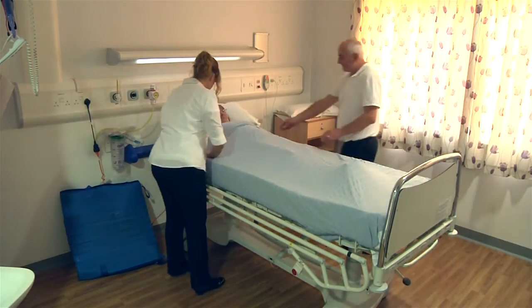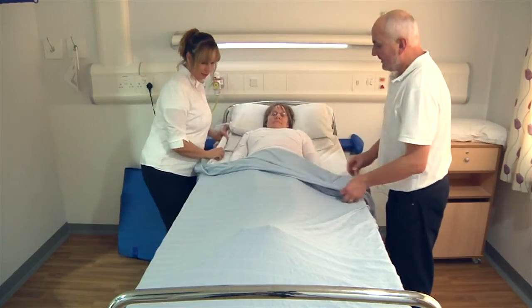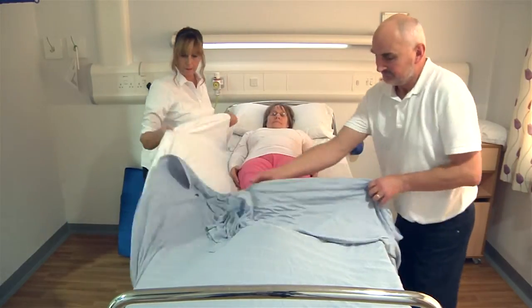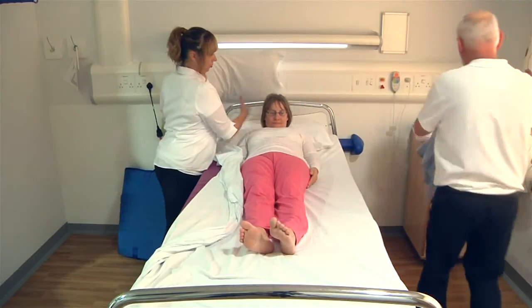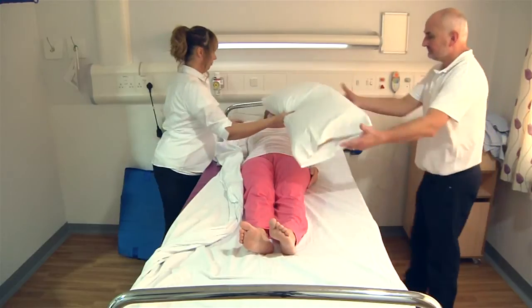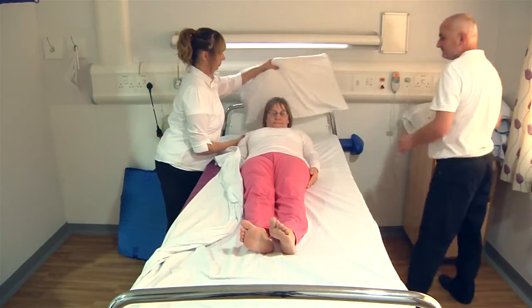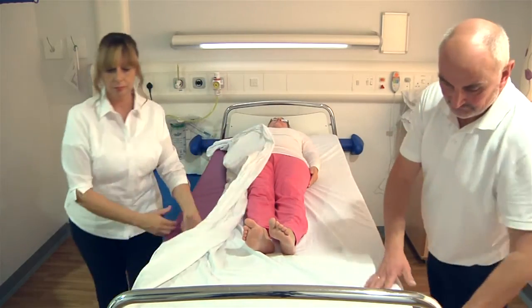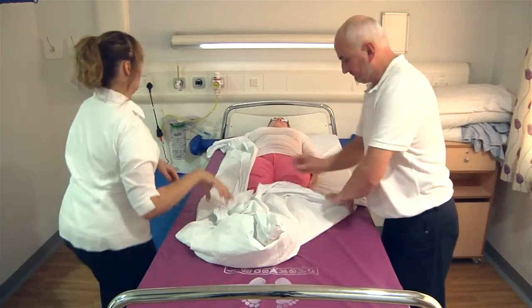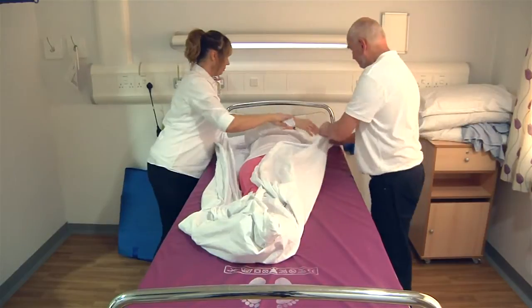If possible, open any doors in readiness for the escape. If time allows, always work with the bed at a comfortable working height. Remove the patient's pillows and put to one side ready for use later. To prepare the patient for evacuation, wrap her in her bedding — this will ensure they are kept warm and adds extra protection.